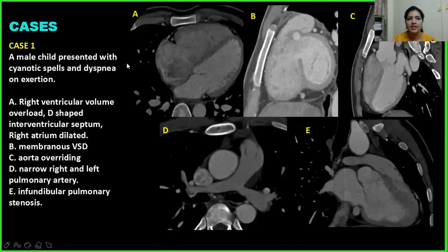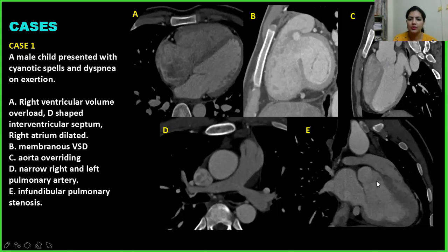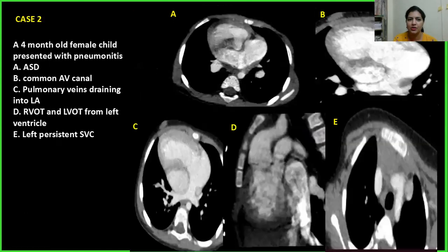Case 1: A male child presented with cyanotic spell and dyspnea. We can see right ventricular volume overload, D-shaped IV septum, and dilated right atrium. There is a membranous VSD, overriding aorta, narrow right and left pulmonary artery, and infundibular pulmonary stenosis. This was a classical case of Tetralogy of Fallot.